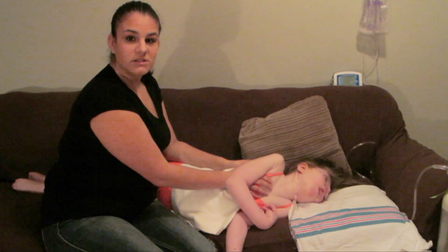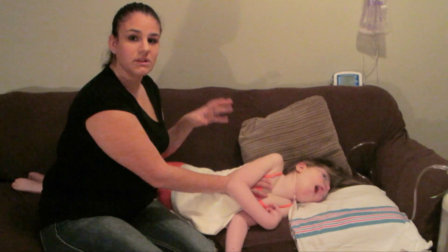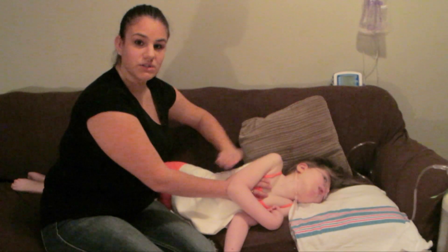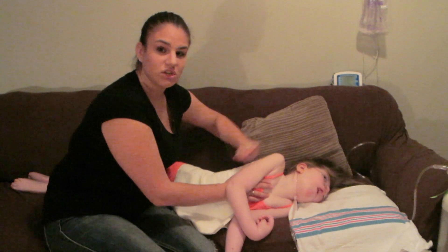I'll be doing this for two and a half minutes. I didn't mention before, but when you're doing the percussions, I work from the lower to the upper — that's because you want everything to go up.